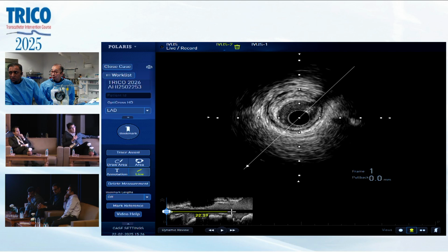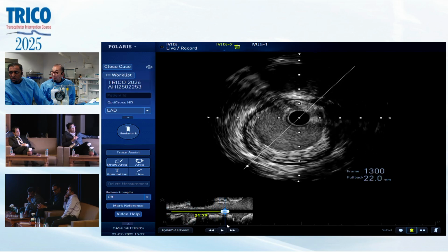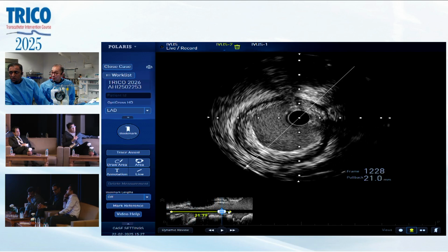Around here, maybe around 20, right? 23 is okay. 2.75 by 23. Okay, should be okay.